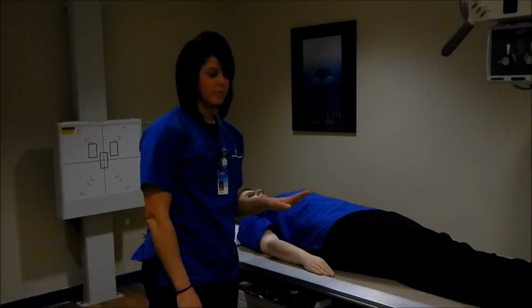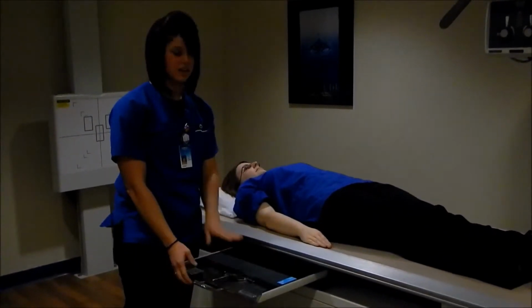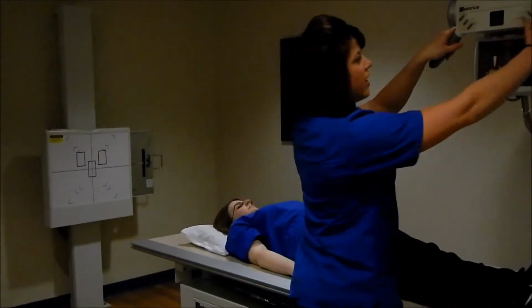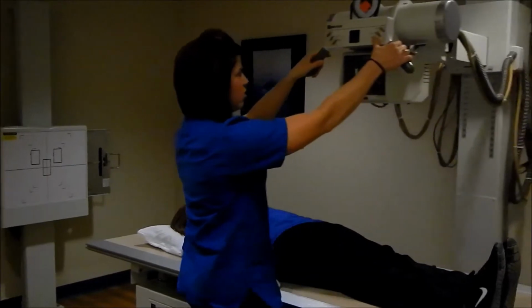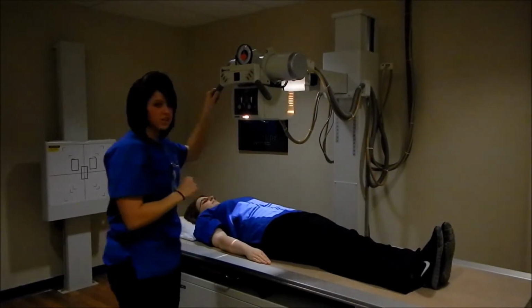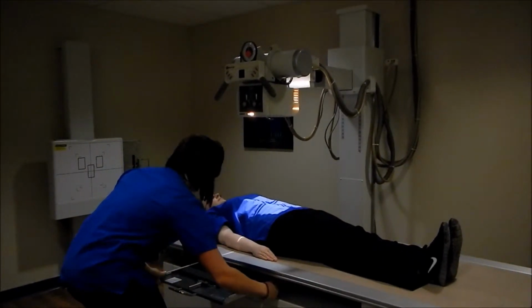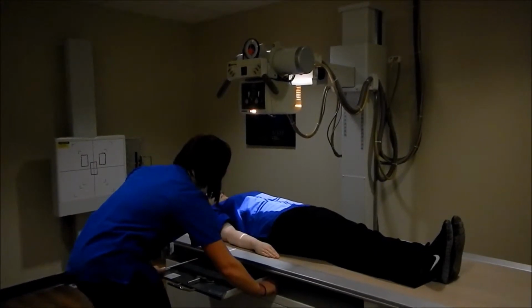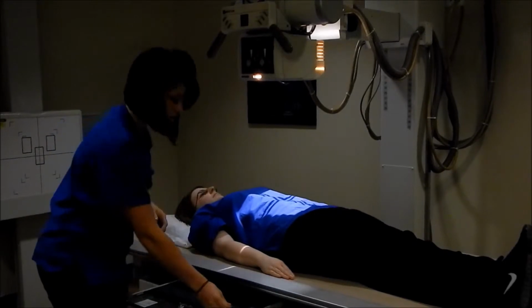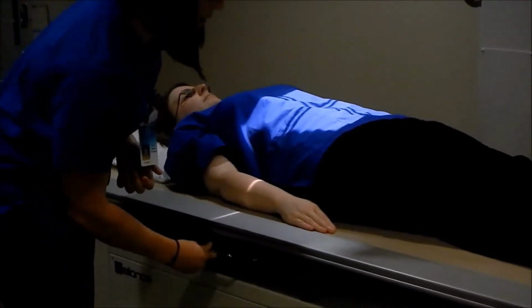They're going to be lying on their back. You're going to need a 14 by 17 cassette, and it's going to be lengthwise. You're going to need to line up your tube with the bucky. This projection is done at 40 inches. You're also going to want to put your marker. I'm using my right marker on the outside so that it is out of the way of the abdomen.